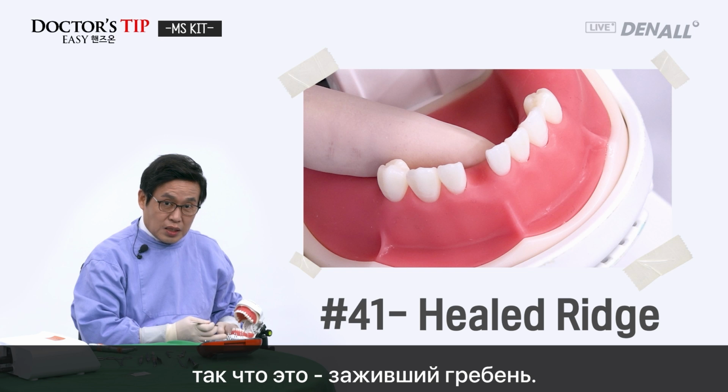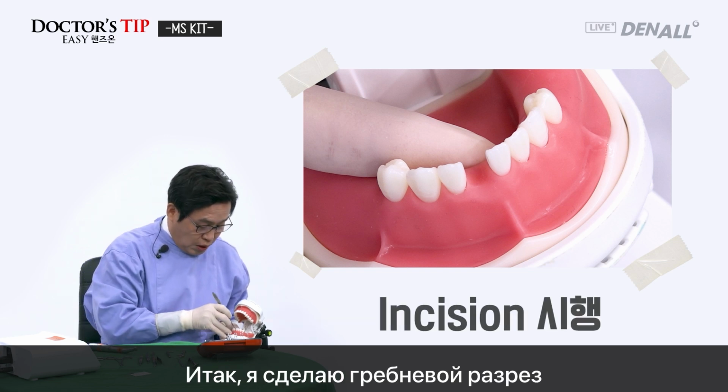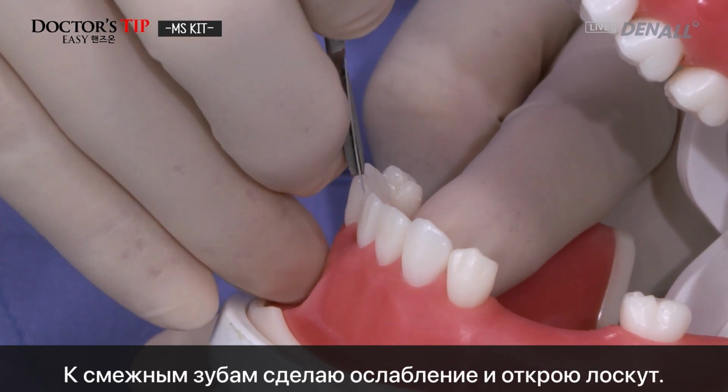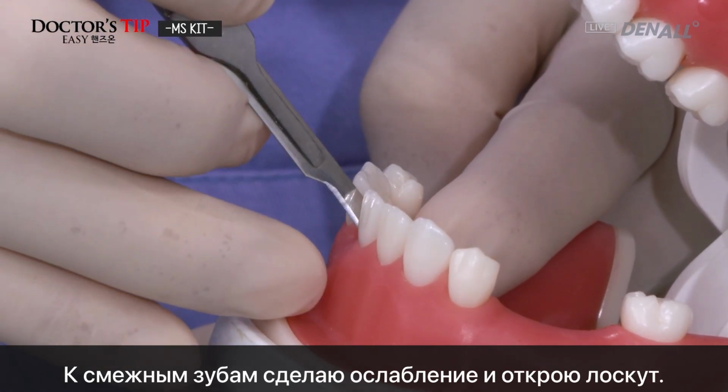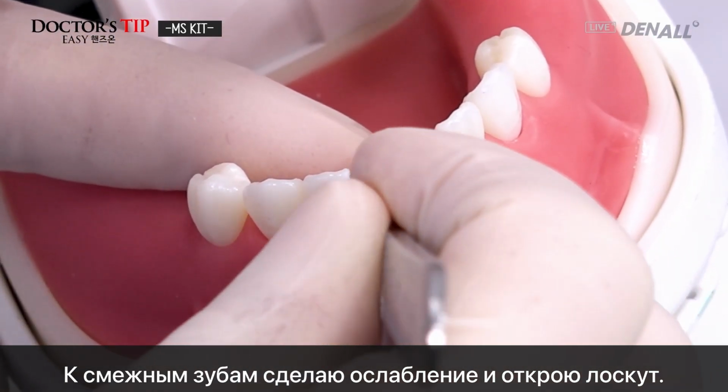It's been a while since the tooth was taken out, so it's a healed ridge. So I'll do a crestal incision toward the lingual side. To the adjacent teeth, I will release and open the flap.